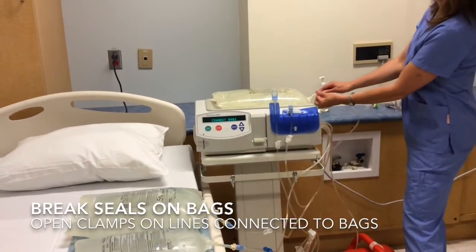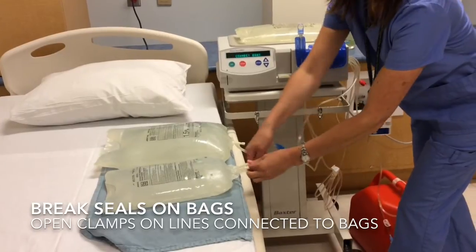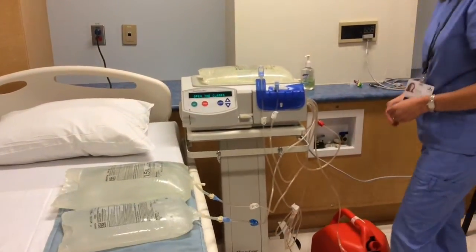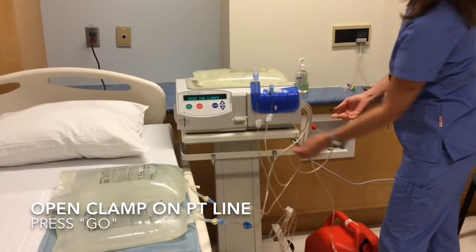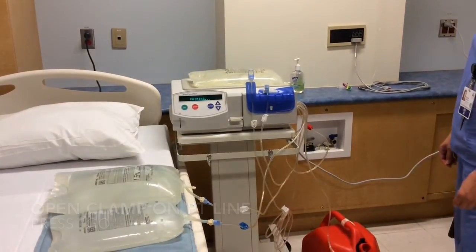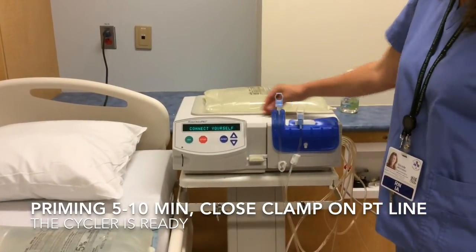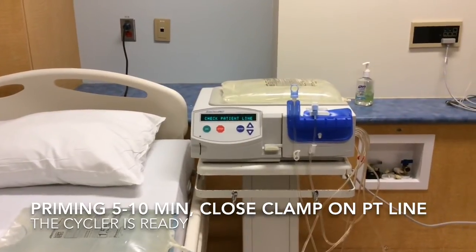Break all seals on the bags. Open the clamps connected to the bags. Open the white clamp on the patient line. Press go and the priming will start. Once the priming is complete — it takes about 5 to 10 minutes — the display will say 'connect yourself, check patient line.' Close the white clamp on the patient line. The cycler is now ready to be used. This setup must be used within 12 hours of setup.